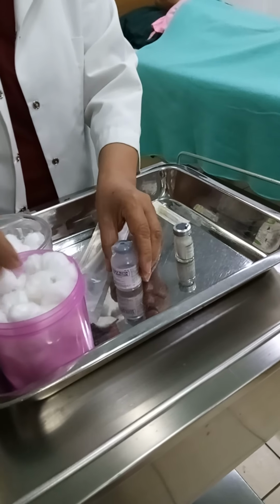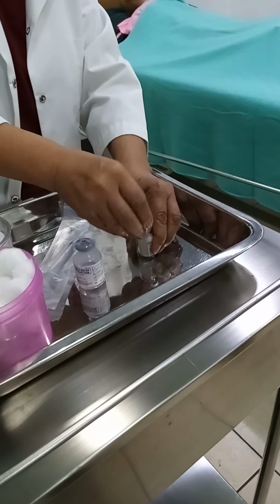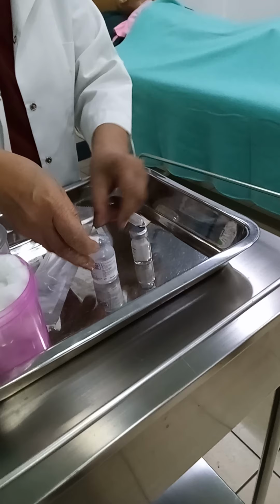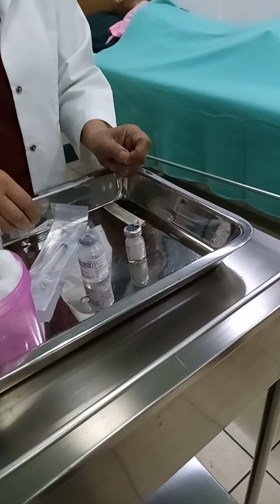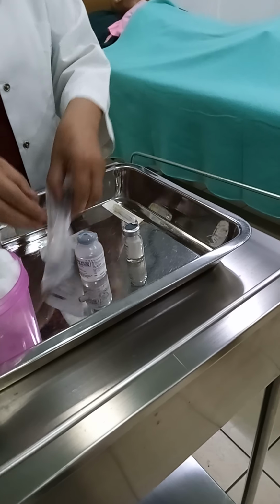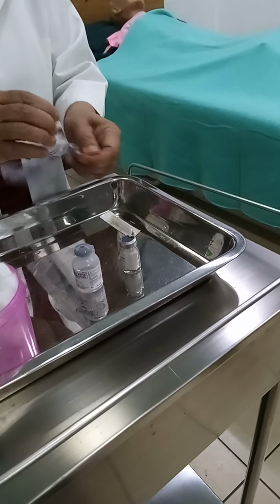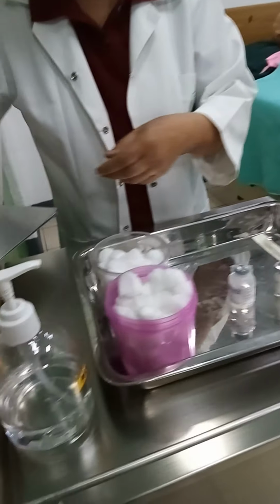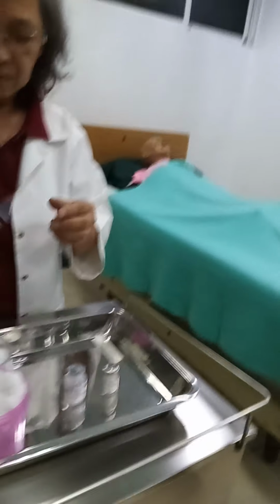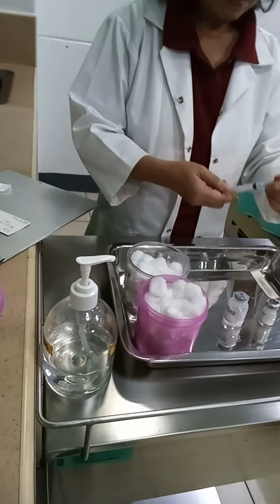Swab both caps with alcohol and allow to dry. Draw up the diluent into the syringe, following the steps that we have with aspirating medications from a solution.